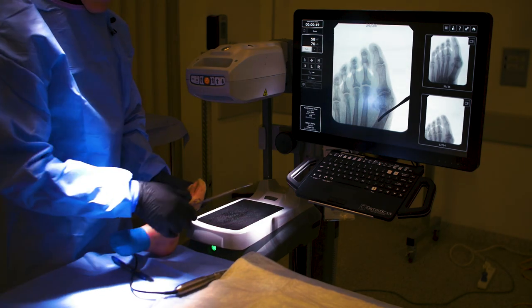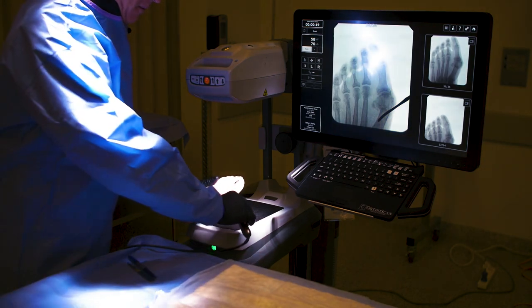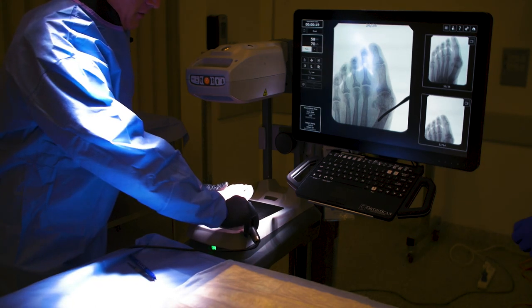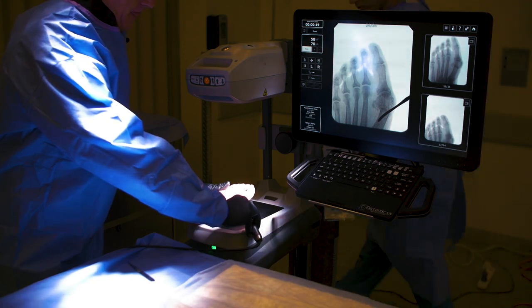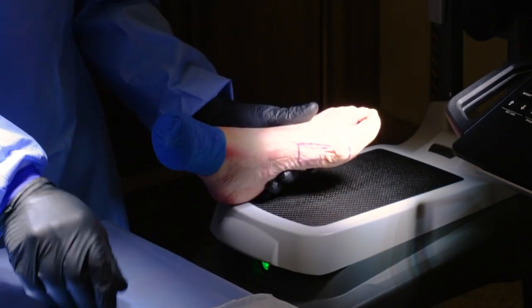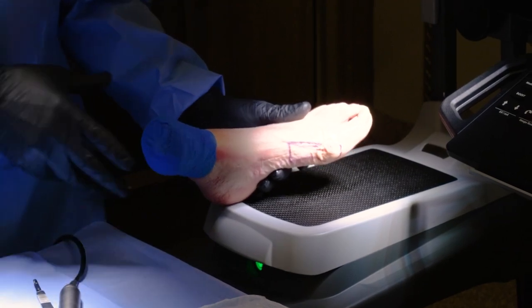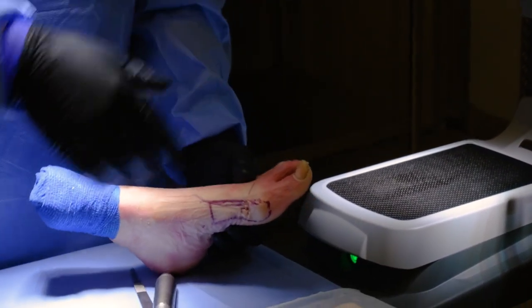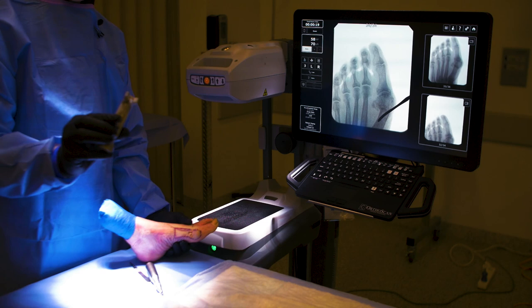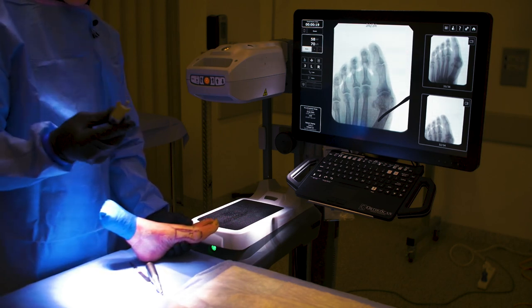One other little trick: when you first put your burr there, or you could use a K-wire, you can mark out on the skin with a marker — just straight in line. Even before you do your cuts, you can see and take less fluoro. These are all the little tricks you can do. Now we're ready to put our guide in, so let's get our guide. The guide has a hook that goes into bone; other competitors go to soft tissue, but the beauty of this is it stays where we want it.